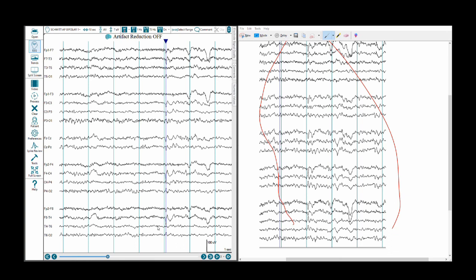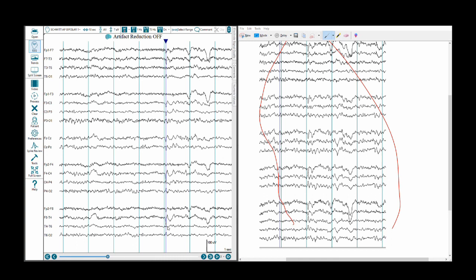If we go down to the last set of electrodes, the right temporal chain, we can see this downward deflection. That is deflecting downward for a different reason than the F7T3 channel is deflecting downward. The F8T4 channel is showing a downward deflection because T4 is really close to where that discharge is being maximally recorded over the scalp. But since it is in input 2, there is a downward deflection. You can even see the aftergoing wave component clearly. And then in the T4, T6 channel, those are essentially recording the same magnitude with respect to this discharge.